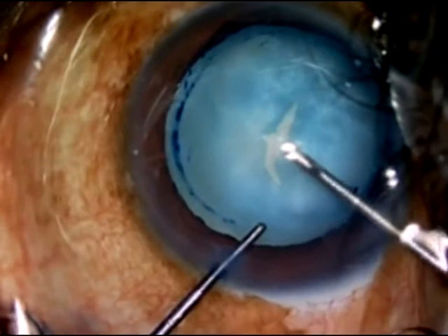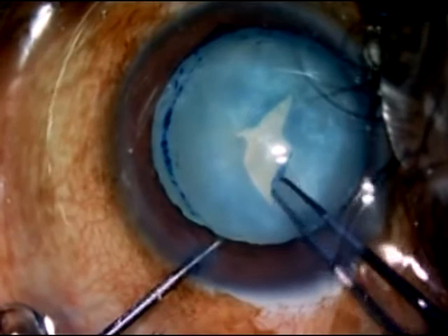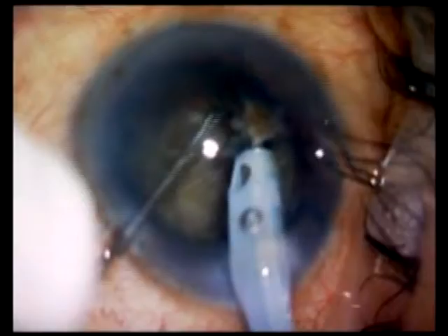What is the problem with the Argentina flag sign? The problem is that the rhexis, because of the extension, can extend across the equator and reach the posterior capsule, thereby producing a posterior capsule rupture and even a nucleus drop, as seen in this video.